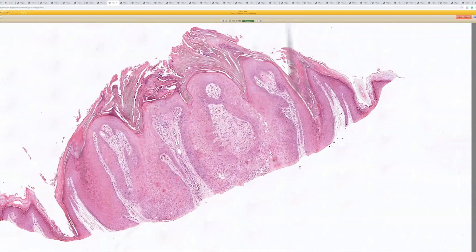Either way, you want to think about it. And the other thing is clear cell acanthoma. Even though this one doesn't particularly look like it, I've certainly seen cases where I kind of struggle to tell apart clear cell acanthoma, trichilemmoma, and inverted follicular keratosis, because they all can kind of have these large rete that are kind of smooth and bulging down, and they all have this kind of pale appearance to them that looks different than the adjacent epidermis.